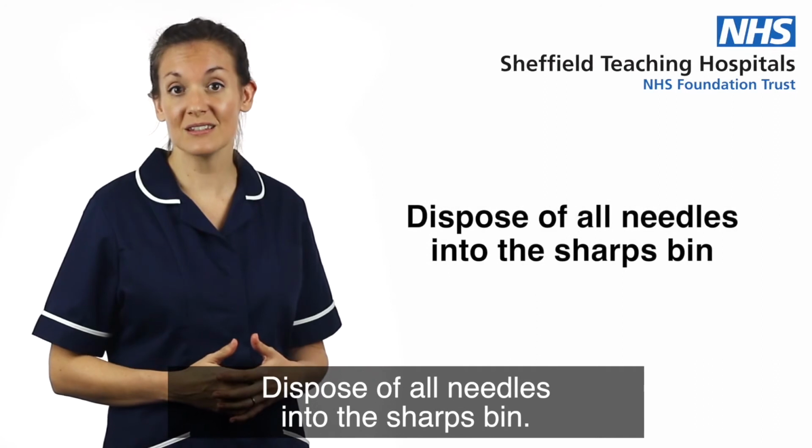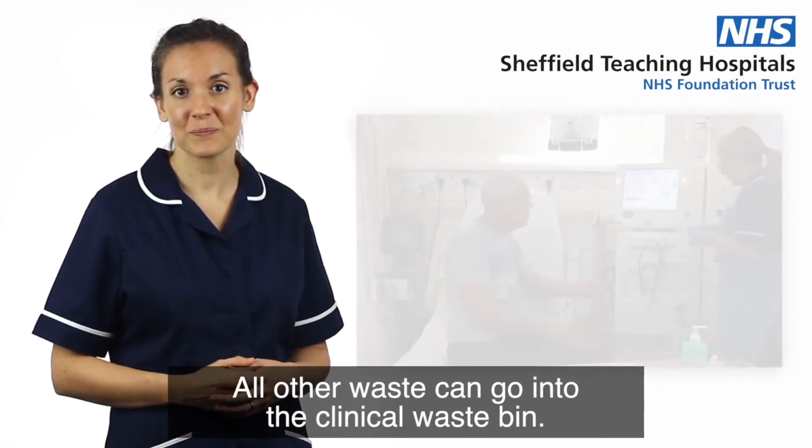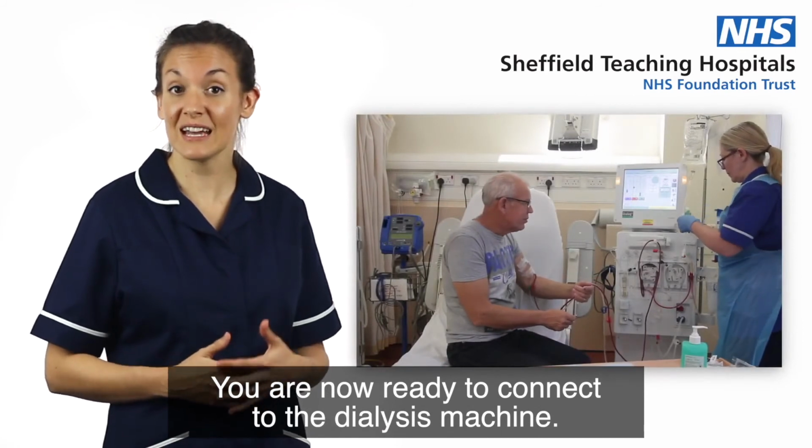Dispose of all needles into the sharps bin. All other waste can go into the clinical waste bin. You are now ready to connect to the dialysis machine.